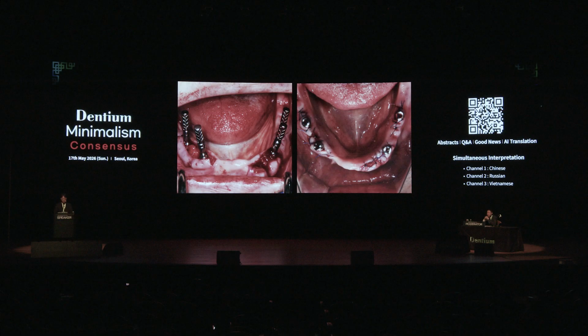In an edentulous patient, guided surgery is very important for implant position and angulation. However, considering alignment error and the tissue-supported condition, I think there is still a high risk of digital error during guided surgery. So in this kind of case, I prefer partial guided surgery. In other words, once initial position and angulation are set, we often switch to freehand surgery, so I can easily adjust the plan if the initial position is not ideal. Anyway, we were able to place the implants minimally invasively as planned.